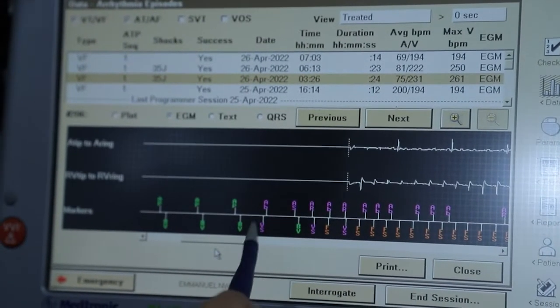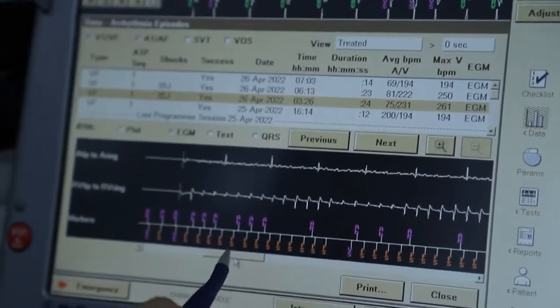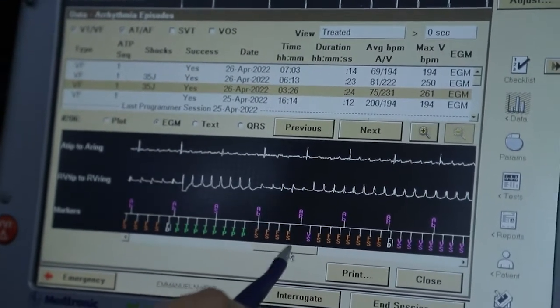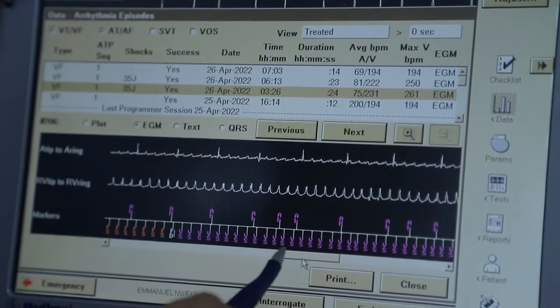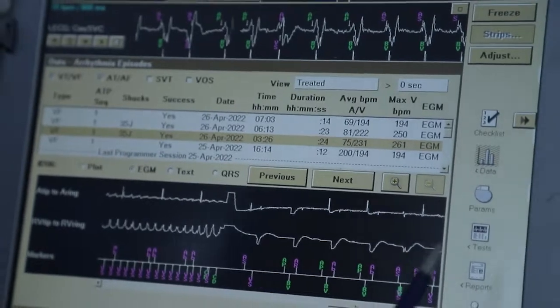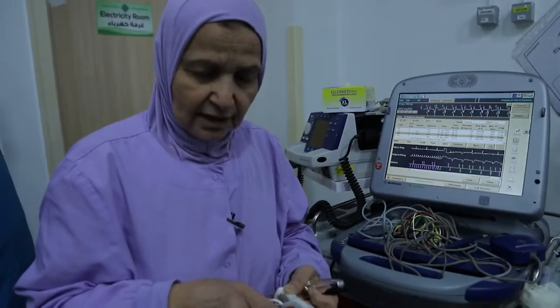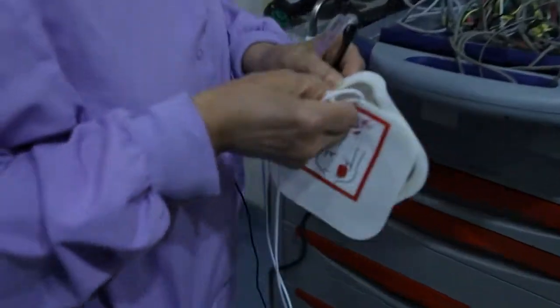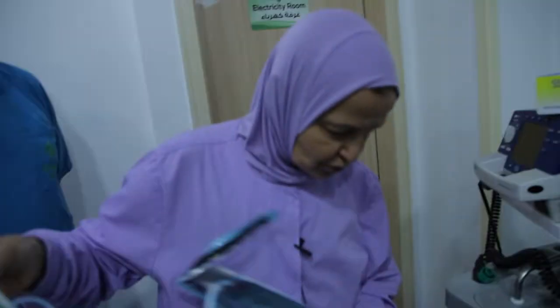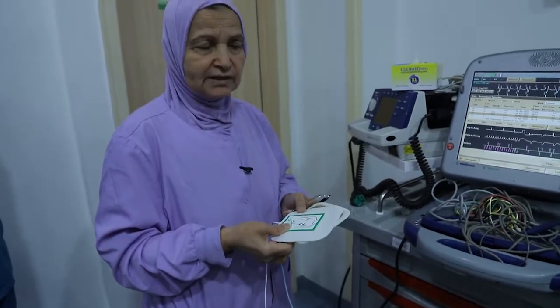He had a lot of PVCs, as you can see, a lot of PVCs firing, the morphology of which I will show in the ECG was coming from this summit. This is antitachycardia pacing during charging, not effective, and VF going, as you can see, VF, shock and termination. So this was the plan put because of this high-risk patient. Also we had these patches for shock connected through a module here. This also helps in case the device shock fails, then you have the external shock. This is all the prerequisite preparation so that the patient is safe. Thank you very much.